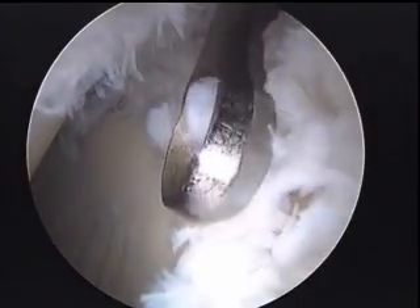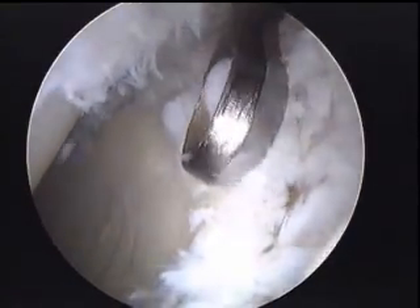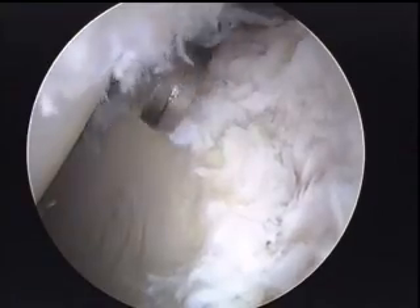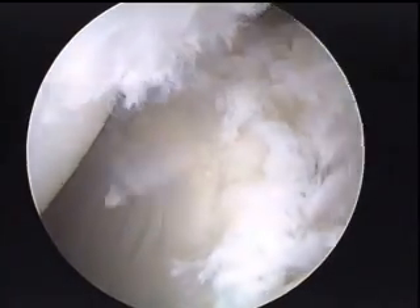We're just using different tools here to debride off the unstable cartilage and frayed tissue around the hip so it does not progress. Eventually this is the area we will trim down some of the rim and try to promote some new cartilage growth with a microfracture of that area.